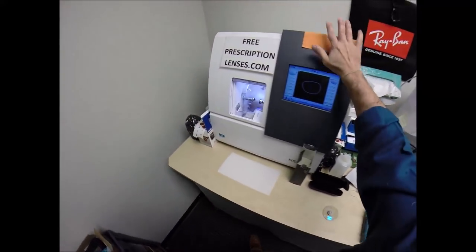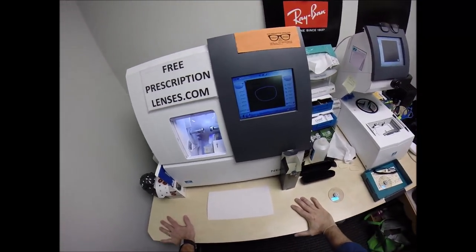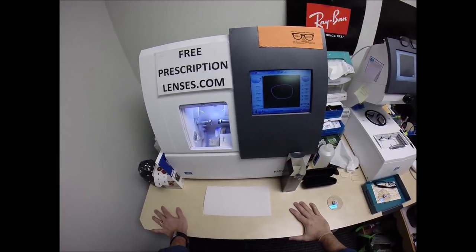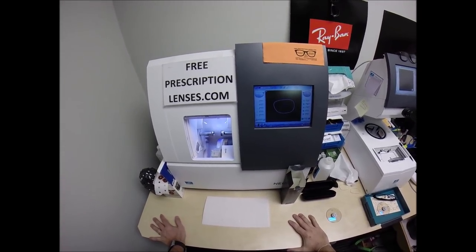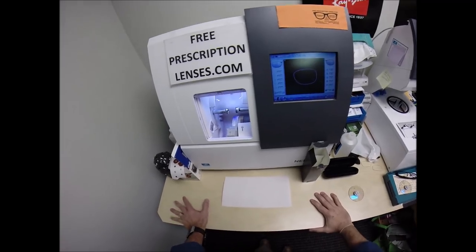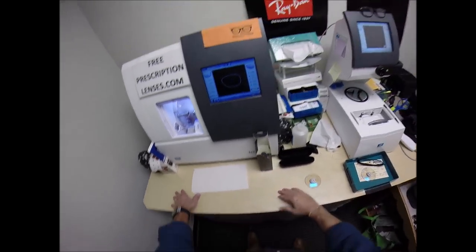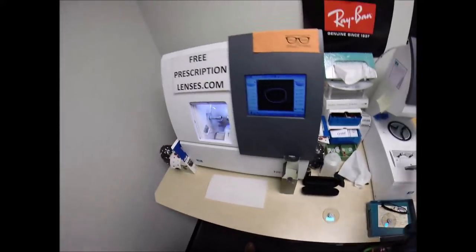Now this is the edger. This is what's going to do all the work while I run my mouth. It weighs 200 pounds. It costs $40,000. I recommend everyone go out and buy their own, put it on your kitchen counter. Then you can cut your own lenses at home, and you won't need this guy with the two thumbs and the bad jokes to do it for you.